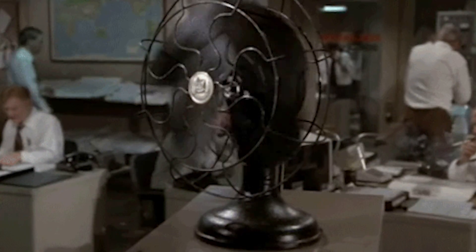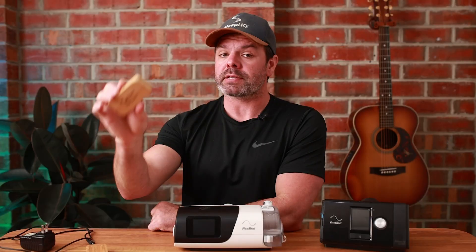Since the MyAir hit the fan, I've had a ton of questions regarding the Sleep HQ Magic Uploader, so I thought I'd tell you a little bit more about it.